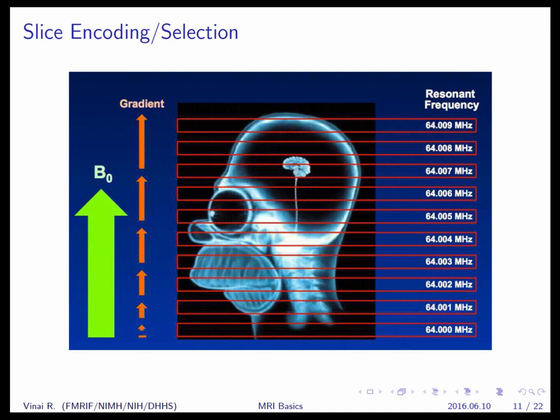Is it true that the spin of the hydrogen protons would differ depending on their environment? So if they're in, let's say, water or bone, or sorry, in tissue cells or in bone or anything like that. So if you're applying the gradient coil, what I'm thinking, or how I'm kind of missing the point, is as you showed earlier, that it goes with the frequency of the atom, and if you're applying the same frequency across, how do you then distinguish between hydrogen protons in different tissues?